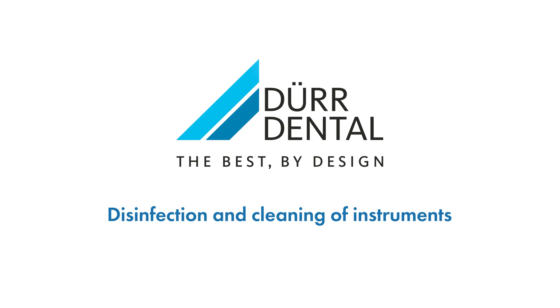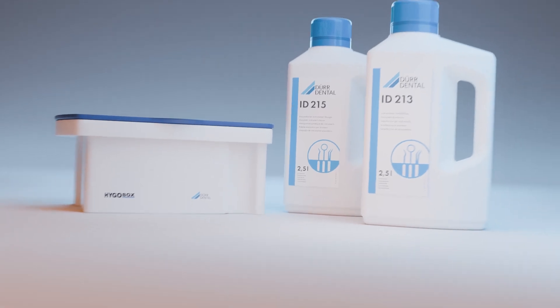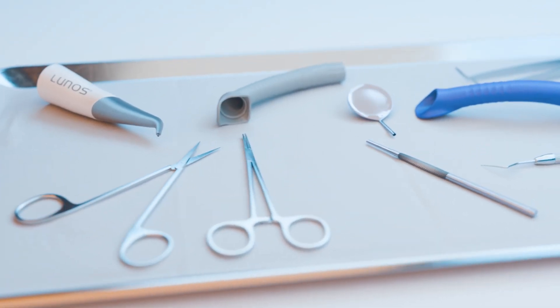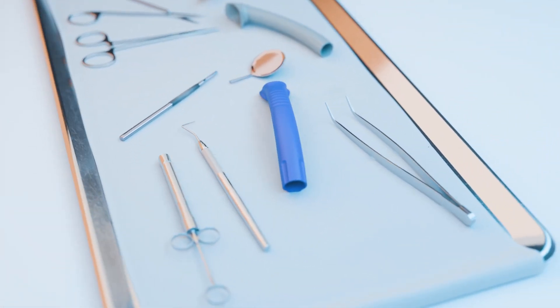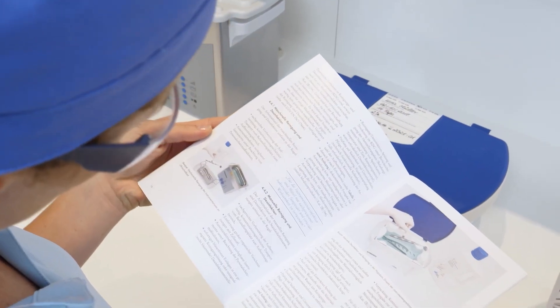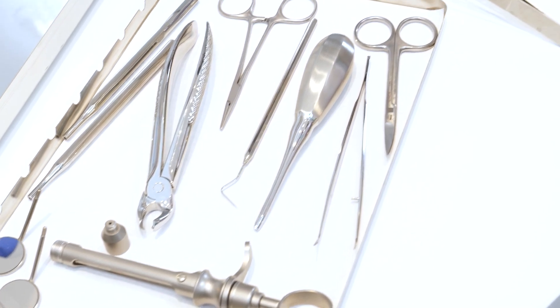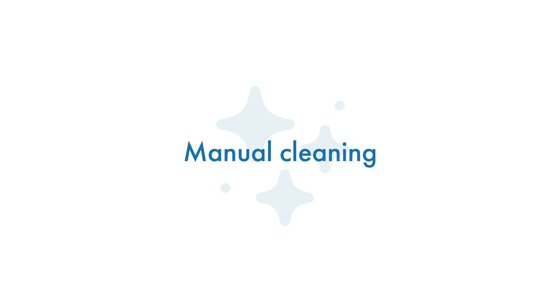Disinfection and cleaning of instruments. Hygienic reprocessing of dental instruments is essential to prevent infections in patients. Safe reprocessing of instruments can only be achieved with clean medical devices. Hence, the cleaning is especially significant in the entire reprocessing procedure.